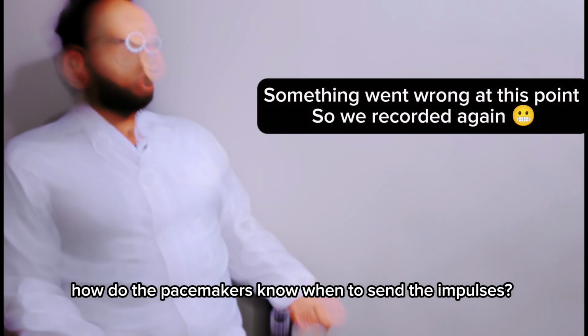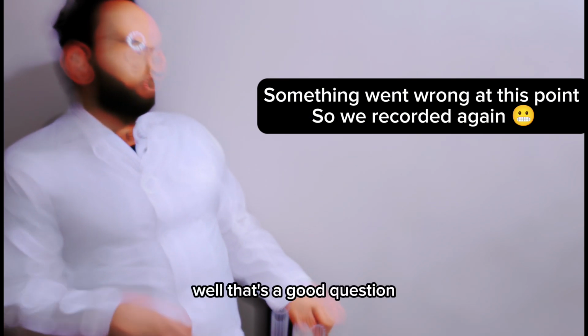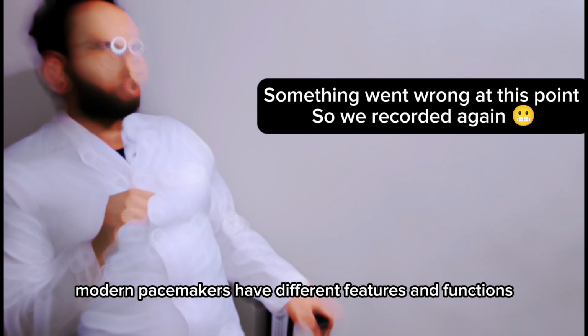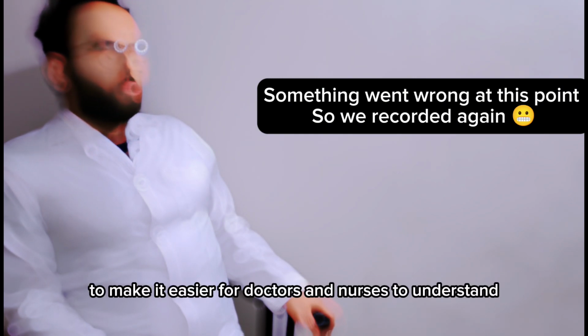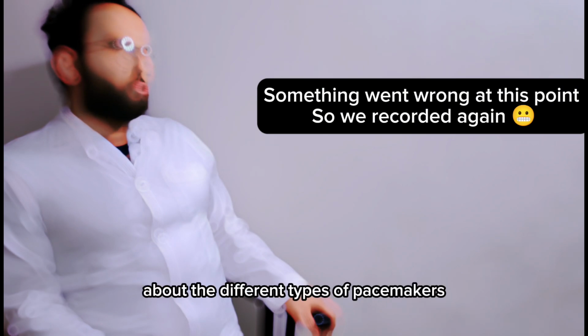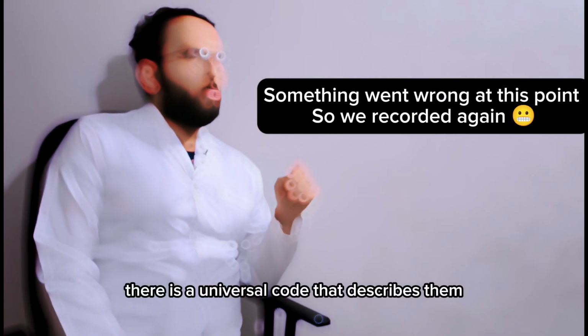But how do the pacemakers know when to send the impulses? And how much? Well, that's a good question. Modern pacemakers have different features and functions that allow them to adjust to the needs of the patients and the situation. To make it easier for doctors and nurses to understand and communicate about the different types of pacemakers, there is a universal code that describes them.